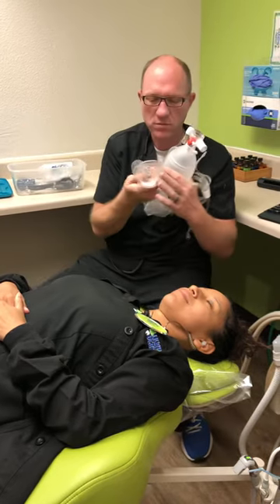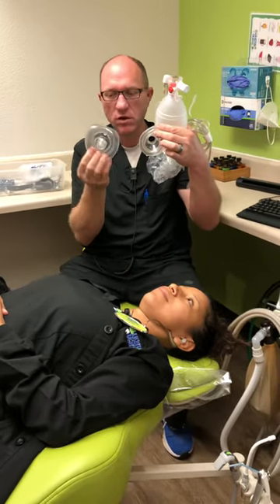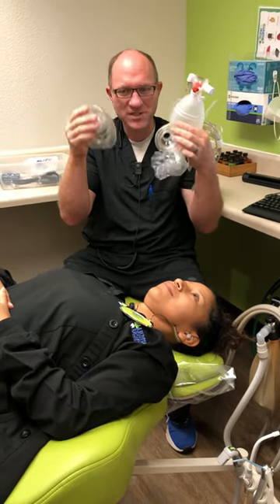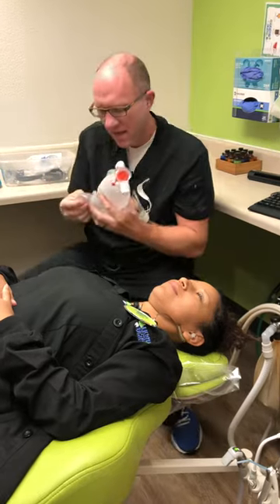One mask is small for a child, and one is larger for more of an adult or a teen. In Lorena's case, we're going to be using the teen size, so we'll grab the larger of the two masks.